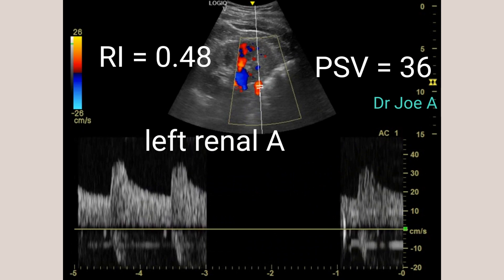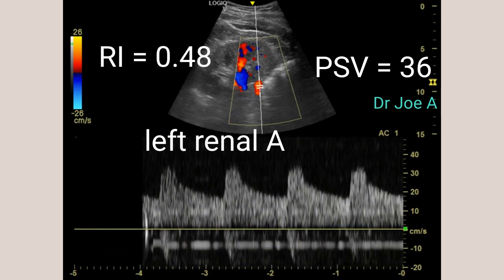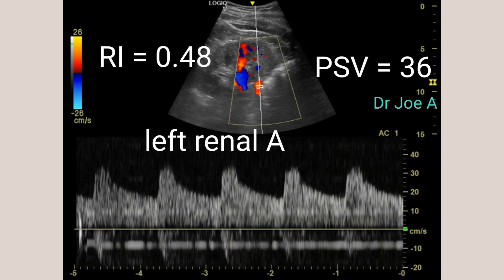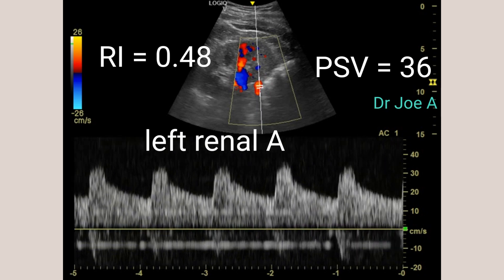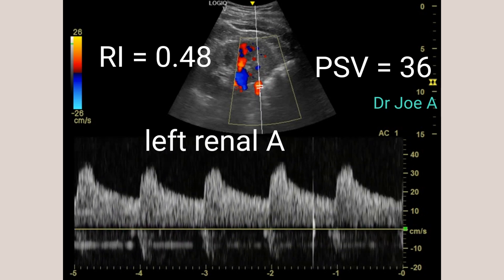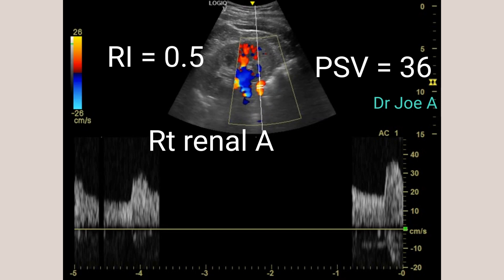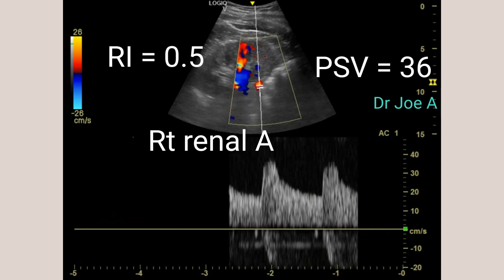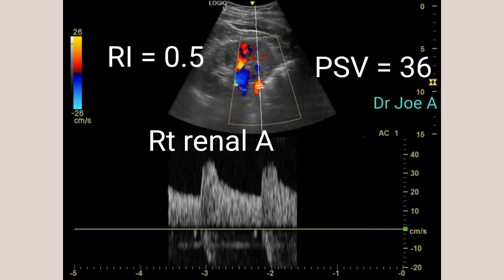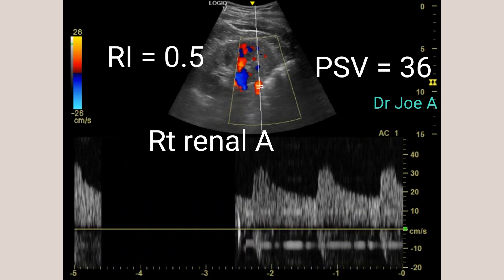The left renal artery shows an RI of 0.48 and a PSV of 36, which is normal. The measurements of renal resistive index range from 0.48 to 0.51, which falls within the upper limit of the normal range. The peak systolic velocity in both renal arteries appears to be normal.